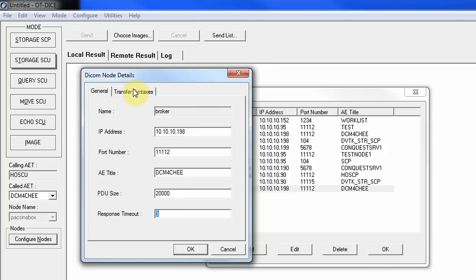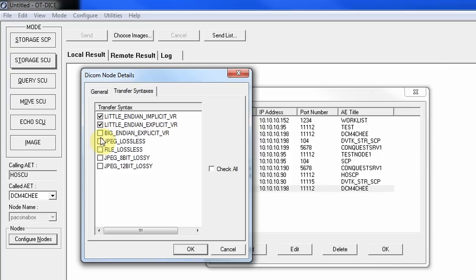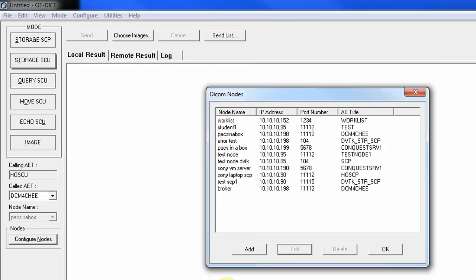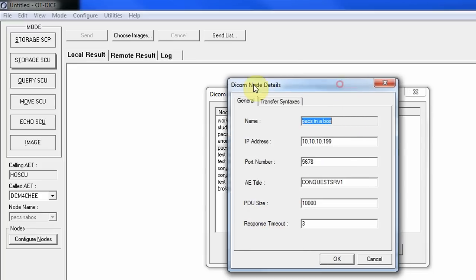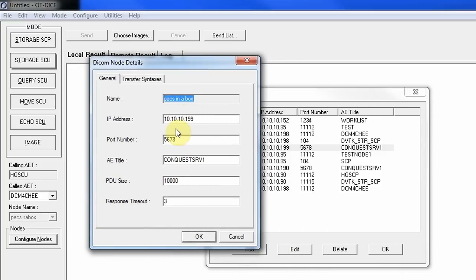Then we specify three transfer syntaxes proposed by this device to the destination. We repeat this process for each destination. For the PAC system, I have a Conquest server at IP 101.99. Note that the port number 5678 shown should actually be 11112 — the Conquest server defaults to 5678, but I'd strongly recommend changing it to 11112 as well.